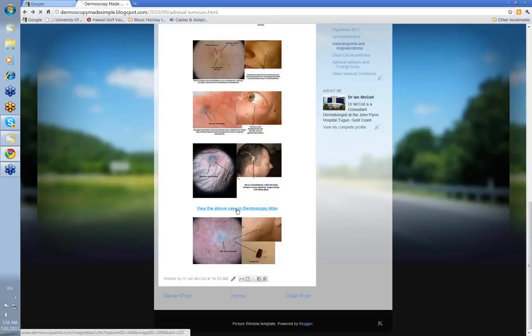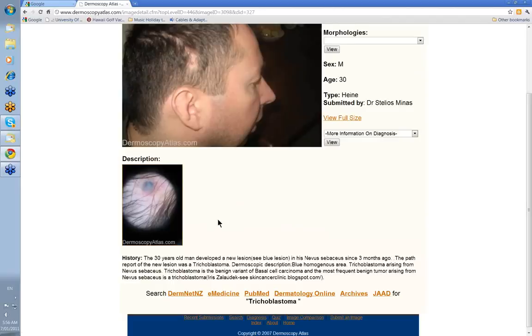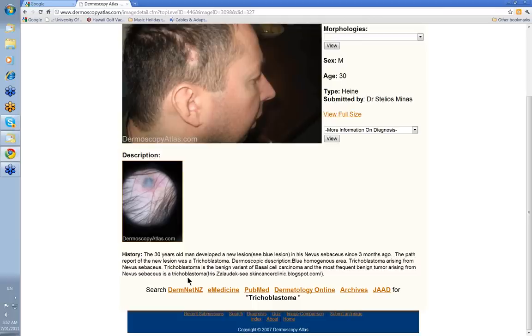You can view this case in Dermoscopy Atlas from Stelius. A 30-year-old man with a new lesion in his nevus sebaceous for the last three months — pathology was reported as a trichoblastoma, though sometimes they'll be reported as basal cell skin cancers. It has a blue homogeneous area. It is a benign variant of BCC and the most frequent benign tumour arising in a nevus sebaceous.